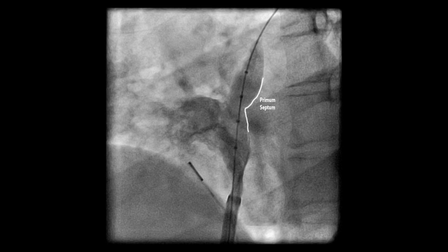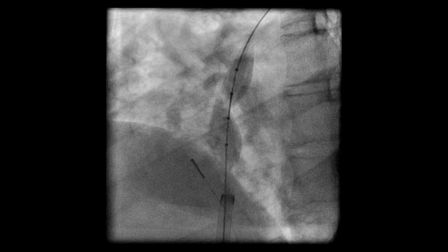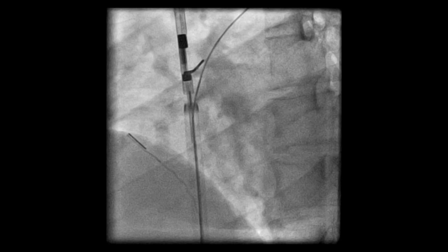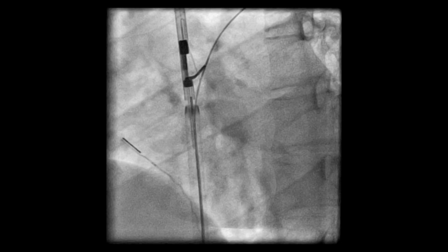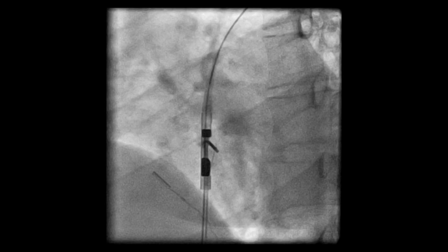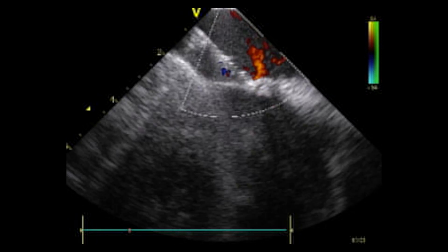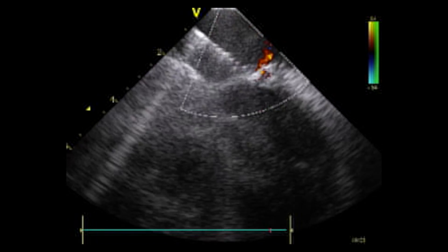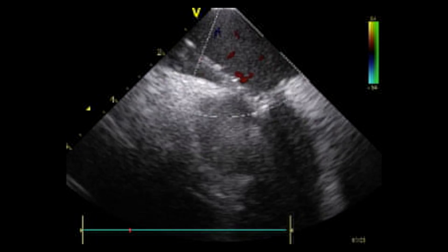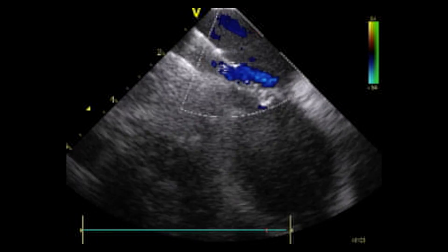Next, we measure the diameter of the PFO, which is shown here to be greater than 1 cm in diameter. Using the same technique, we apply a second Noble Stitch EL device into the septum secundum and then the septum primum. After placing the second suture in the septum primum, the quick knot will be advanced over those sutures, drawing the septum primum into the tunnel, effectively closing the PFO with a reverse valve, as shown here on ultrasonic guidance.